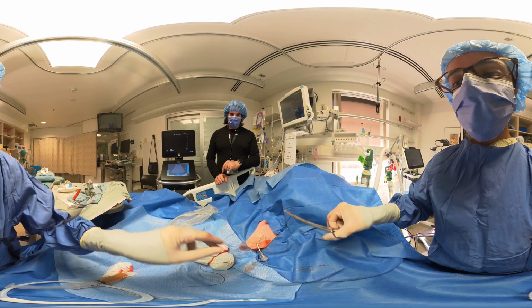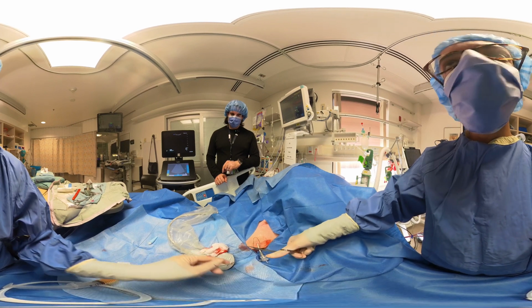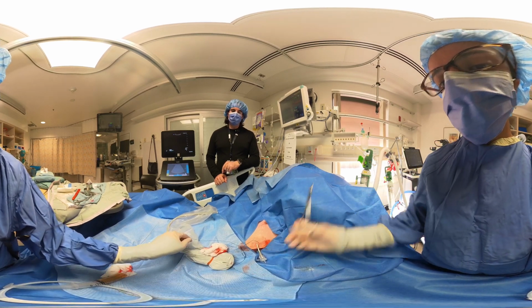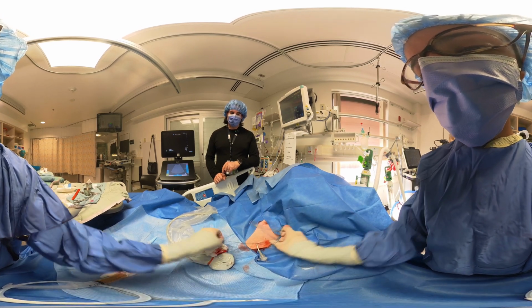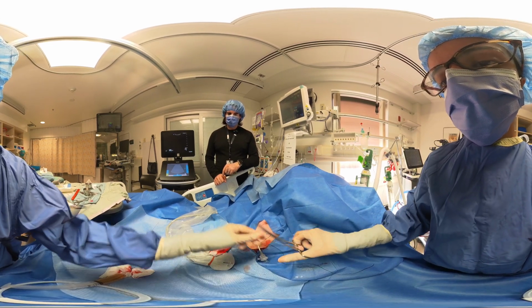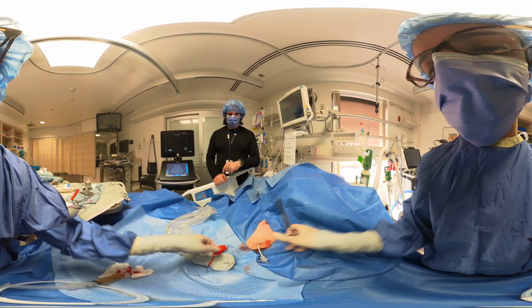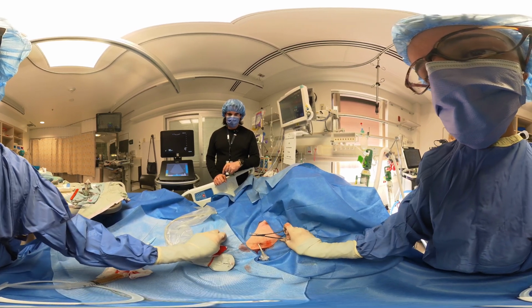Okay. Wait, how do I usually do it? Hold on. I'm under pressure. Like this, a regular knot? That works fine. Yeah, no, it doesn't need to be anything fancy, to be honest. Hand ties are actually strikingly the same. They just look more complicated than they truly are. But like I said, if you want to learn how to do hand ties, I can help. I would love that. Throw on a couple. Great. Okay.